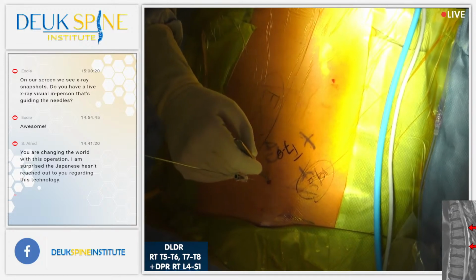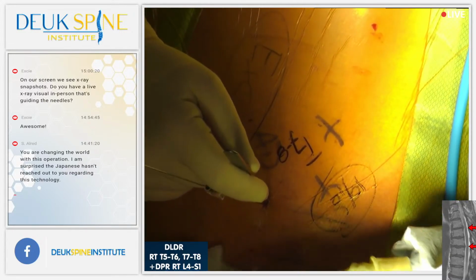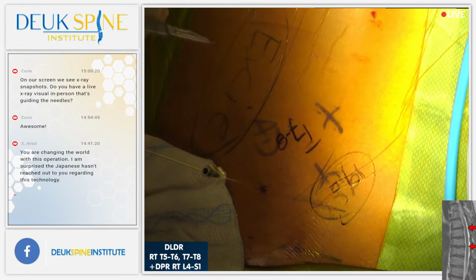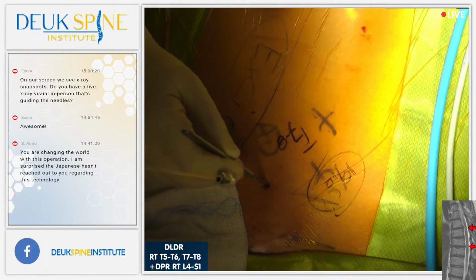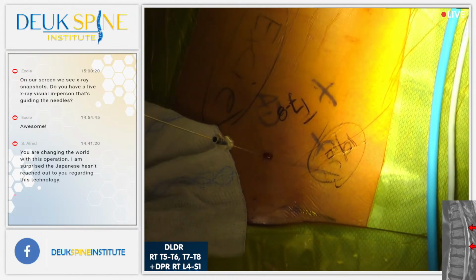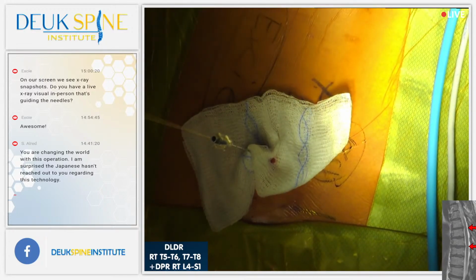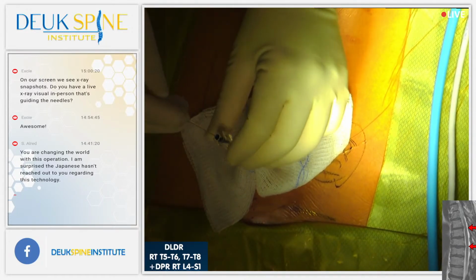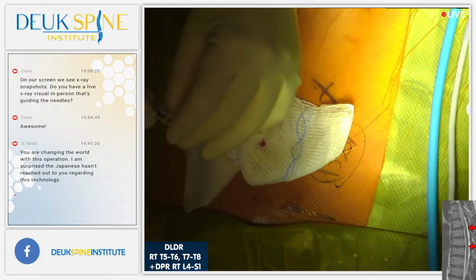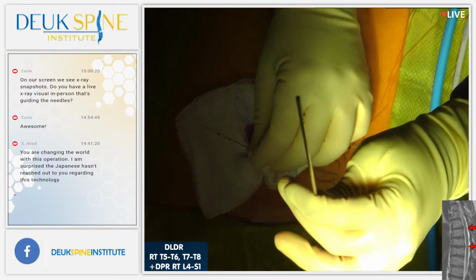We're going to make our incision. It'll be a 4 millimeter incision. This is a stab incision we call for endoscopic surgery, right along where the tube is going to go down along the guide wire. And you can see from the lateral x-ray shot, she has the guide wire in the disc where the discogram was done. You can see the dark dye in the disc.